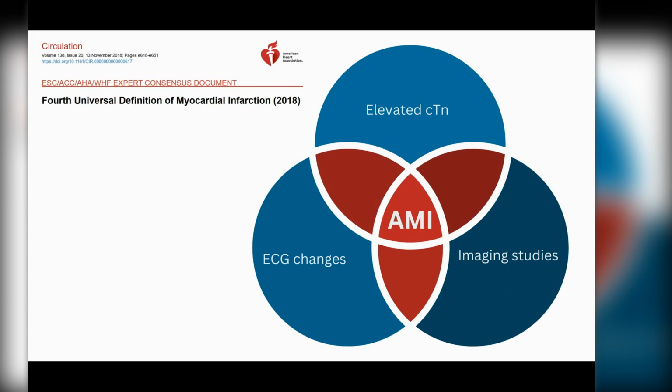So whether or not you're admitted or have further investigations that include angiography often very much depends purely on the elevated troponin level. I do agree that sometimes it's ECG and sometimes it's symptomatology, but the troponin is a big driving thing. So when you think about the clinical assay in use, if for any particular patient that's not elevated, then often those patients are discharged.